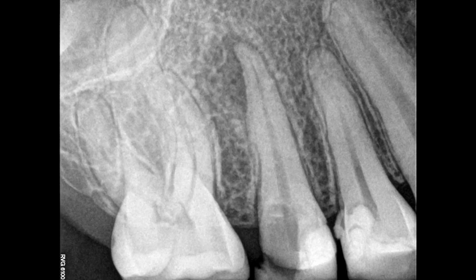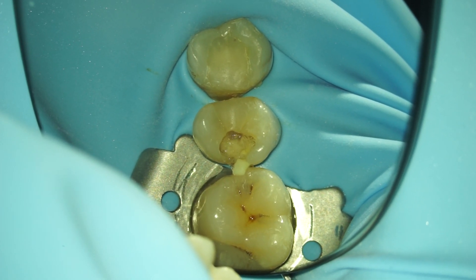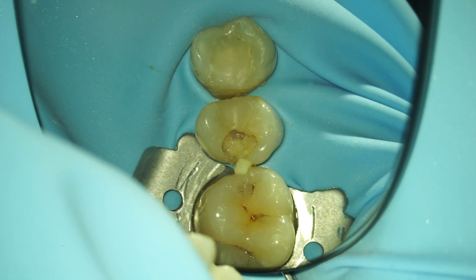As you can see, it's tooth 1-5, the upper right second premolar. The patient was pregnant and didn't want any anesthesia. First things first — always apply a rubber dam. If you don't use the rubber dam, shame on you, quit your job.